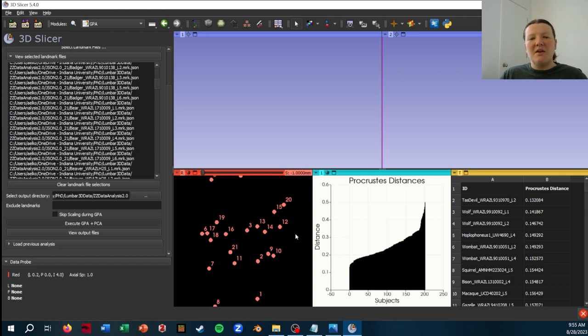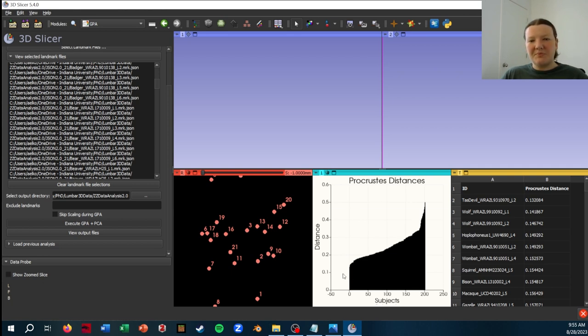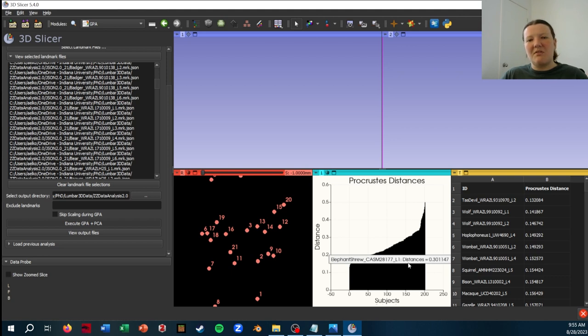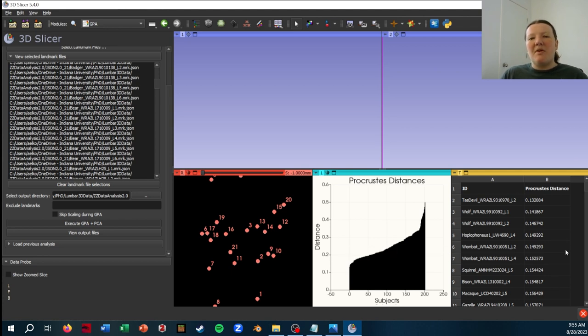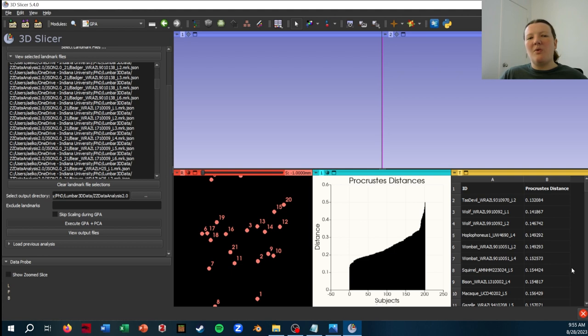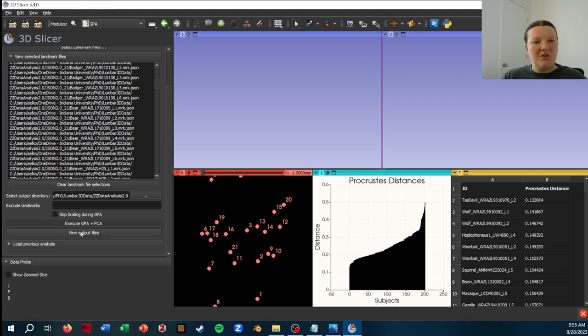So this is a mean shape, but shown in slice view. This is our PCA window right now. It's just showing the Procrustes distances, but we can also use it to visualize the PCA. And then this is a table of the distances. So if you want to right away, just get your landmark data out to go directly into R or your other coding language of choice, you can click this button, View Output Files.